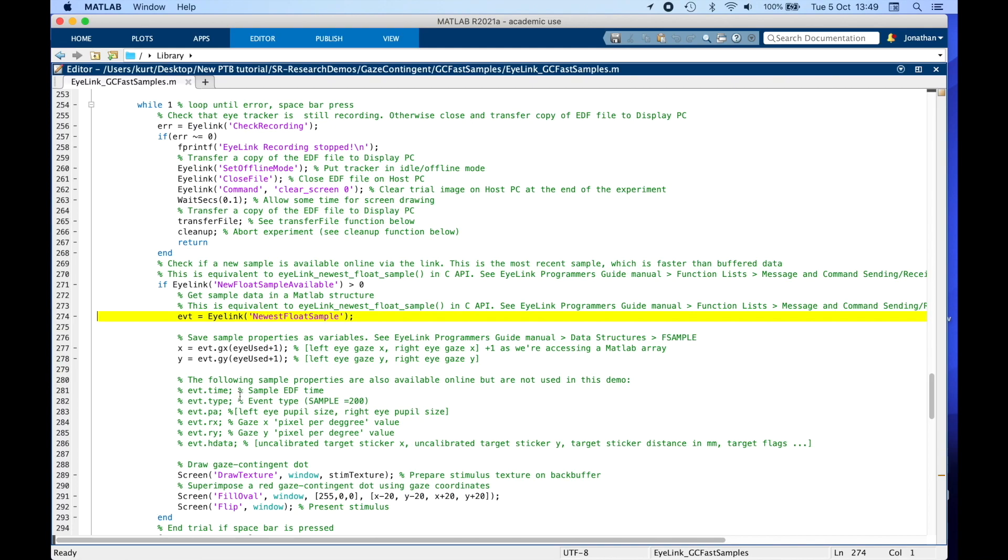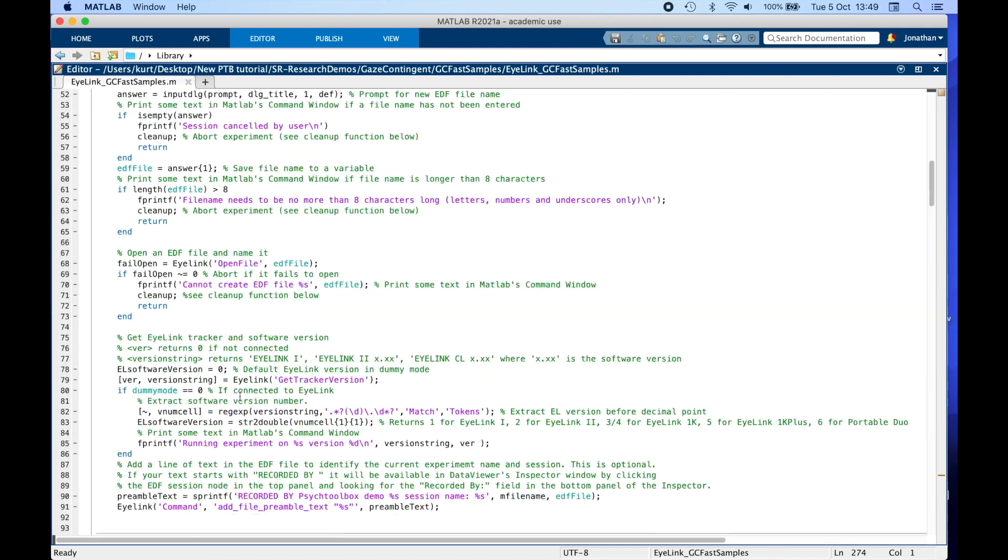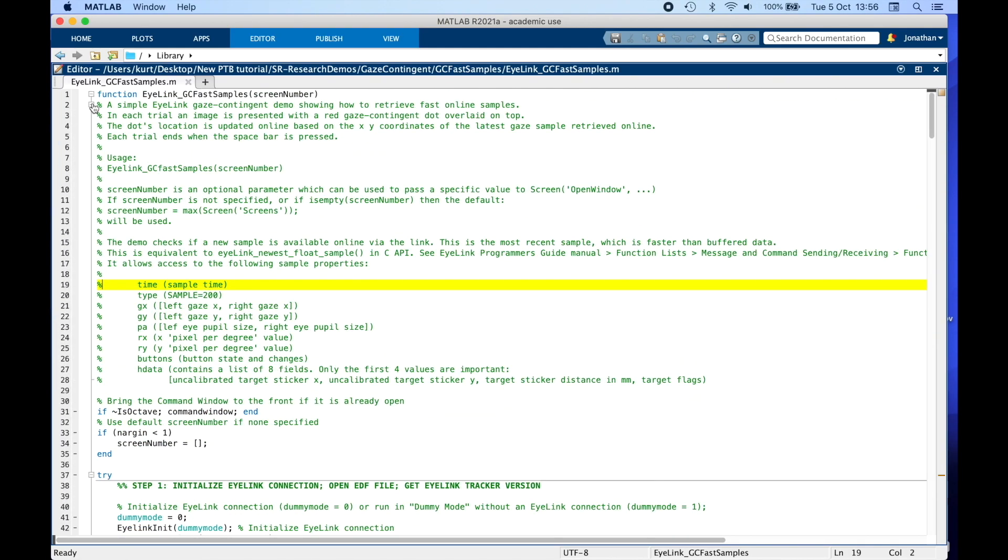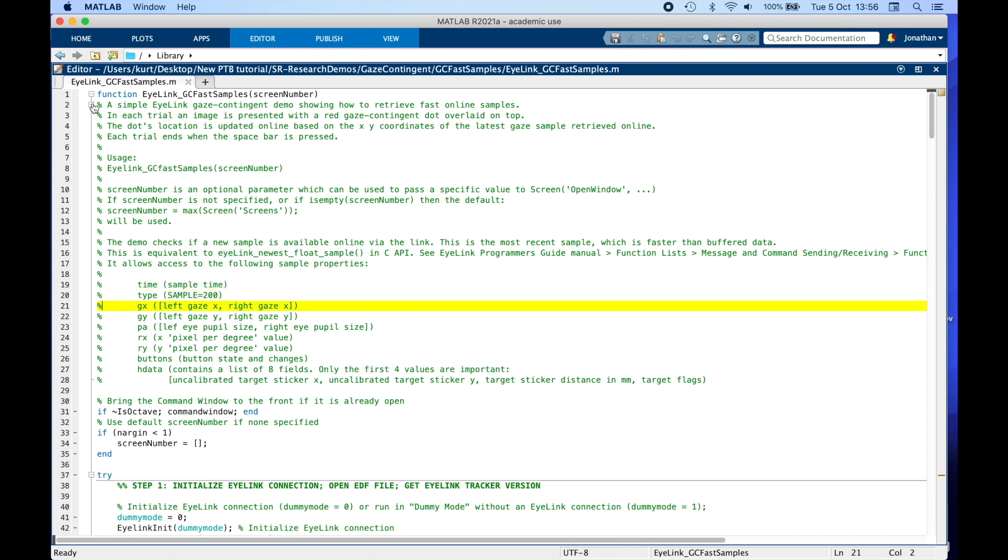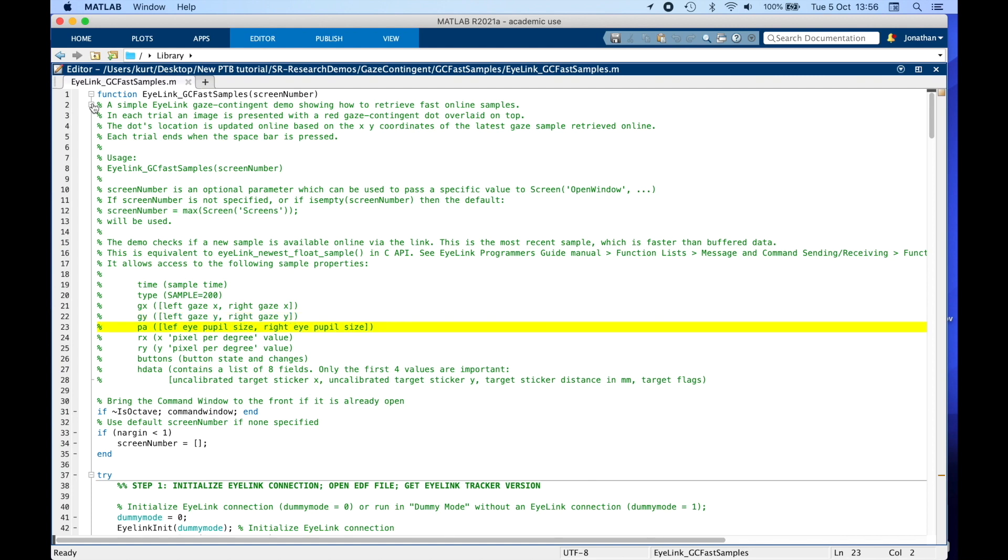If we scroll up to the top, we can see a list of values returned in the structure. So at every sample we can retrieve time, which is the EDF timestamp, type, in this case sample which will have the value 200, GX, which is an array consisting of two values, left gaze x position, right gaze x position, GY, an array consisting of left gaze y position and right gaze y position, PA, an array with two values, left eye pupil size, right eye pupil size, and some additional values.